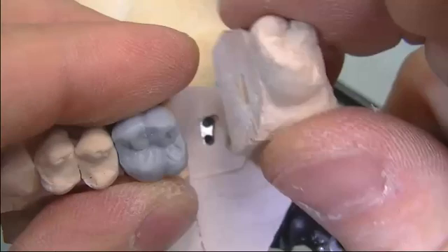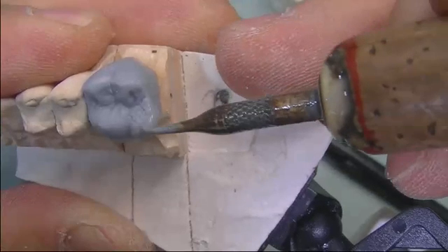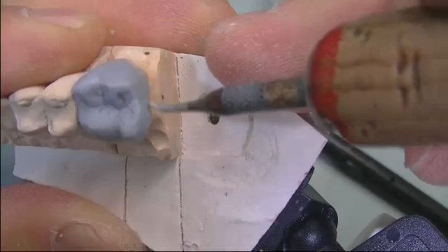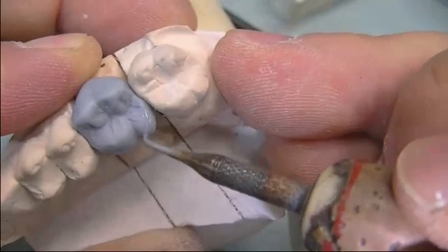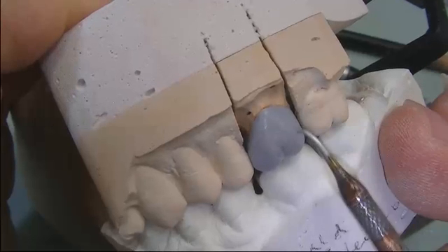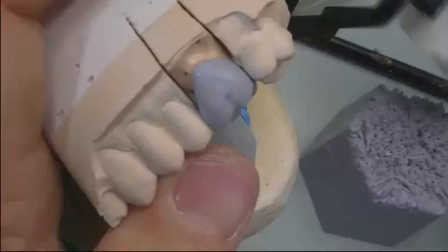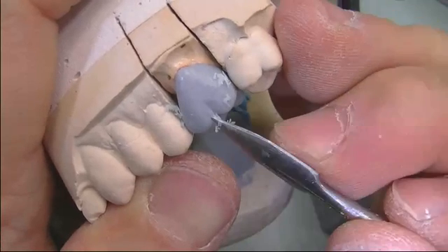Giving the final touches to the completed maxillary first molar. Here we have the completed maxillary first molar.